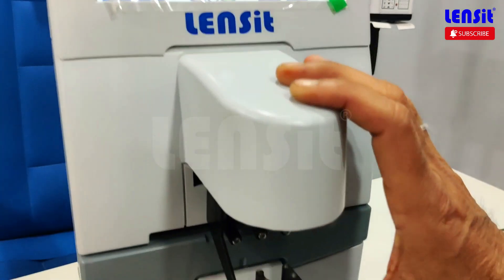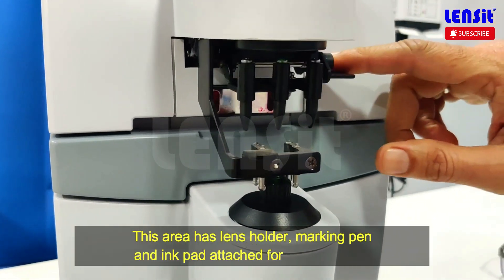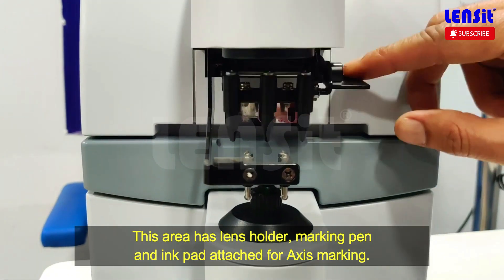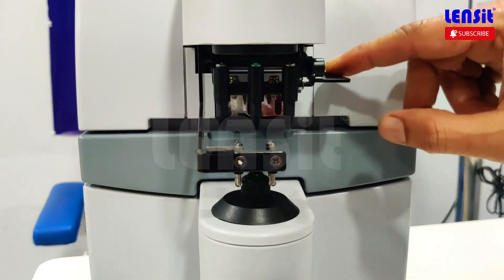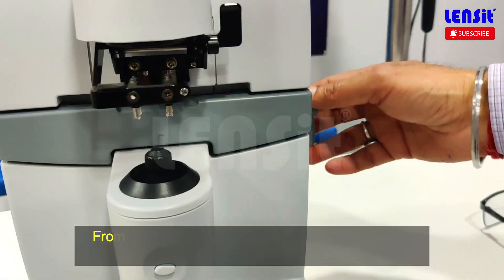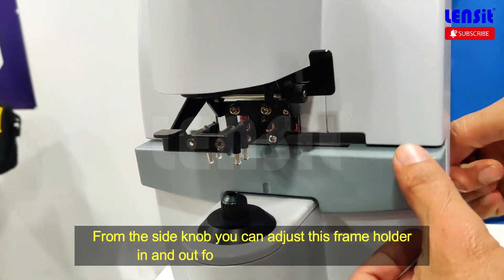The other thing is that this is a lens holder. This is a marking pen. Under this is an ink pad. Here you can use it to mark the lens. If you have access to it, you can use it to mark it. Plus, this is the holder.